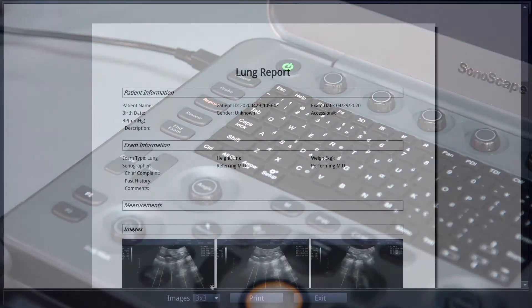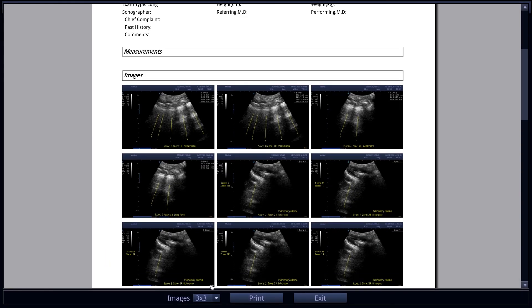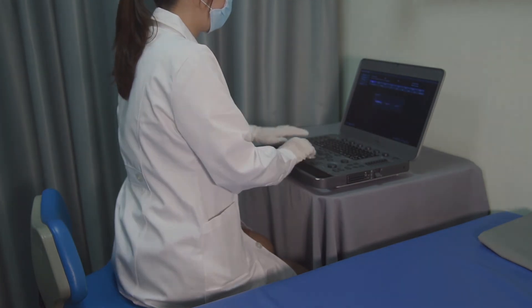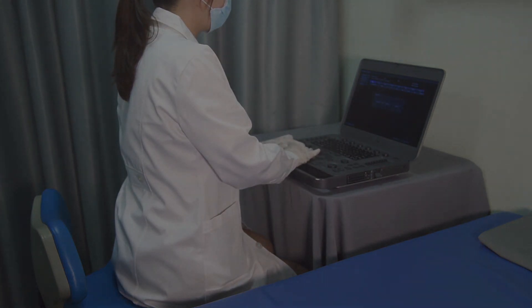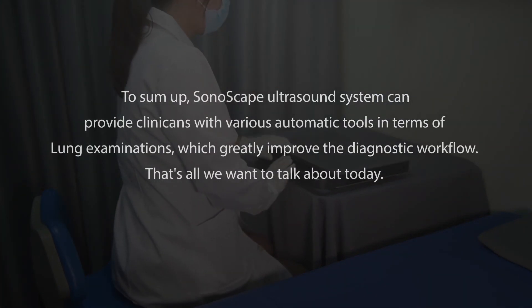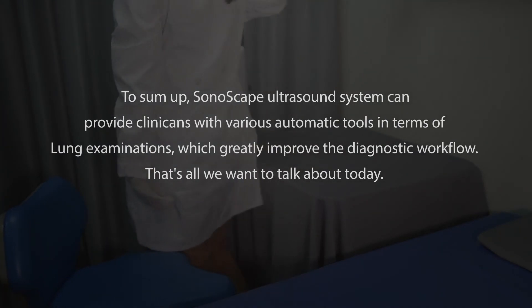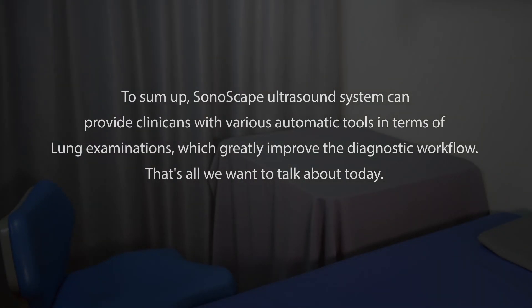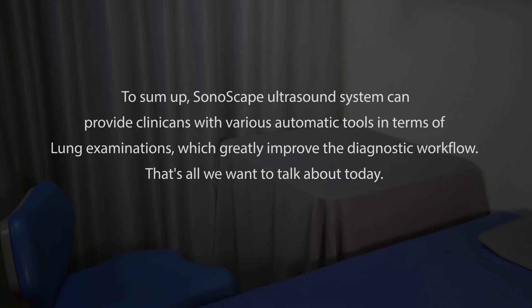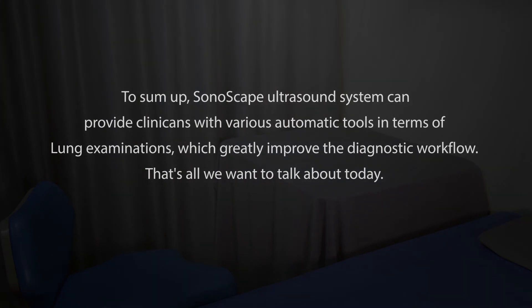Eventually, with stored images, a regular lung report is generated. To sum up, the Sonoscape ultrasound system can provide clinicians with various automatic tools in terms of lung examinations, which greatly improve the diagnostic workflow. That's all we want to talk about today. Thank you very much.